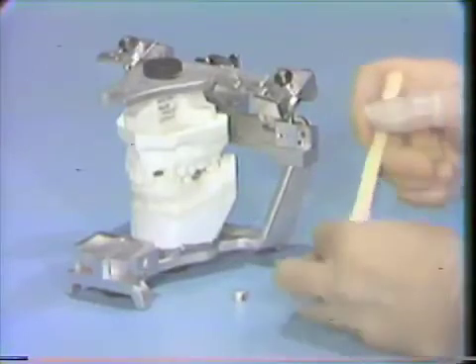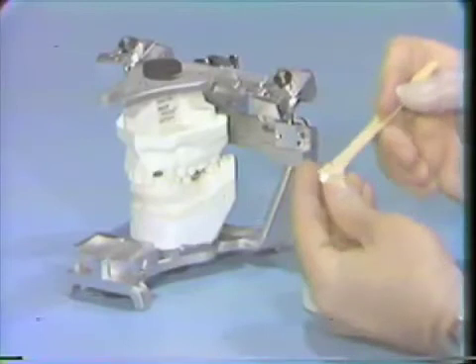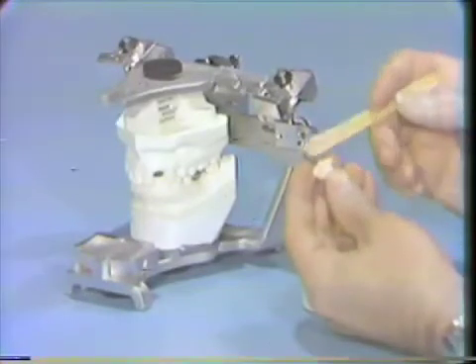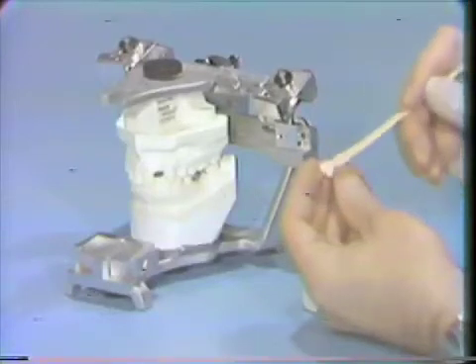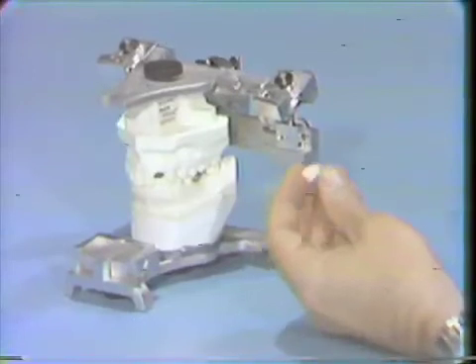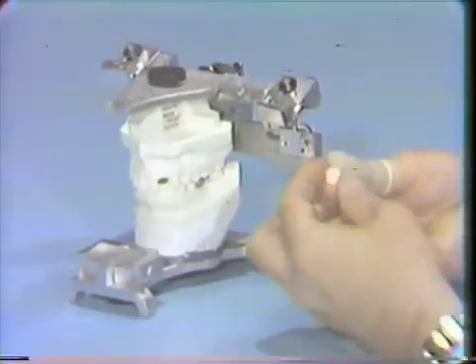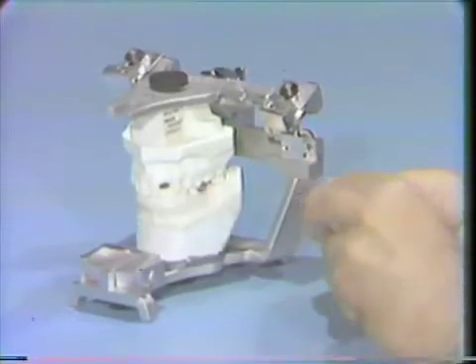We'll fill our little shell crown with the material, and when it's lost its gloss or gone through the stringy stage, we'll insert it into the mouth. The reason for allowing it to proceed through the initial stage of set is so that the patient will not be subjected to as much free monomer.